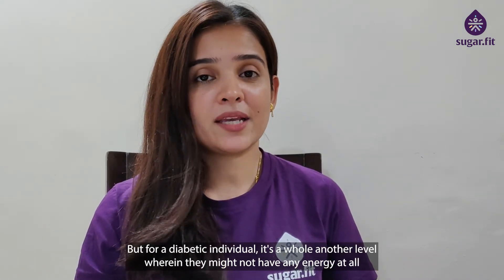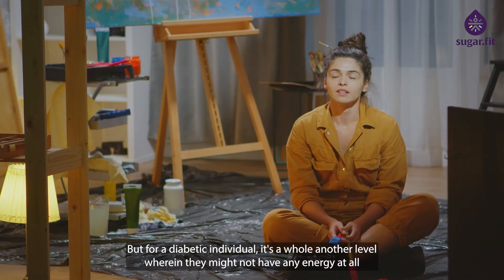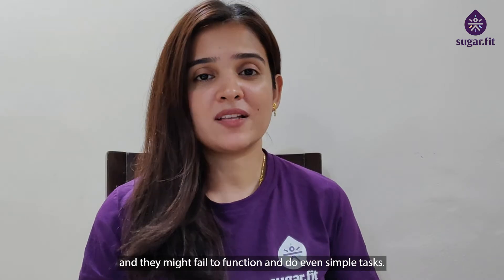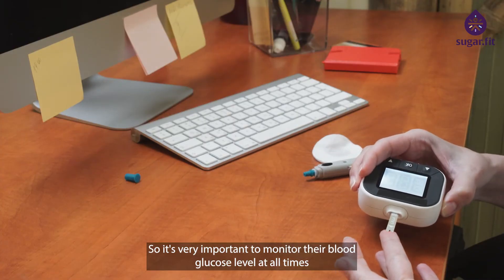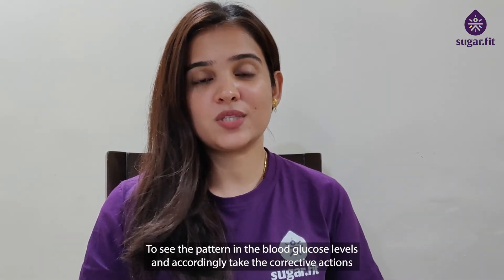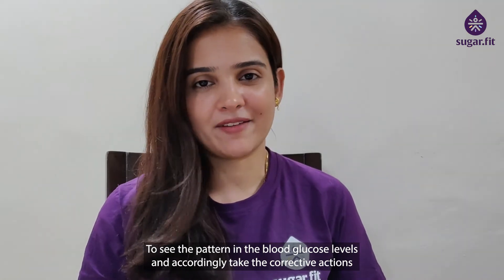But for a diabetic individual, it's a whole other level — they might not have any energy at all and might fail to function and do even simple tasks. So it's very important to monitor their blood glucose levels at all times. This is possible with the help of CGM, to see the pattern in blood glucose levels and accordingly take corrective actions.